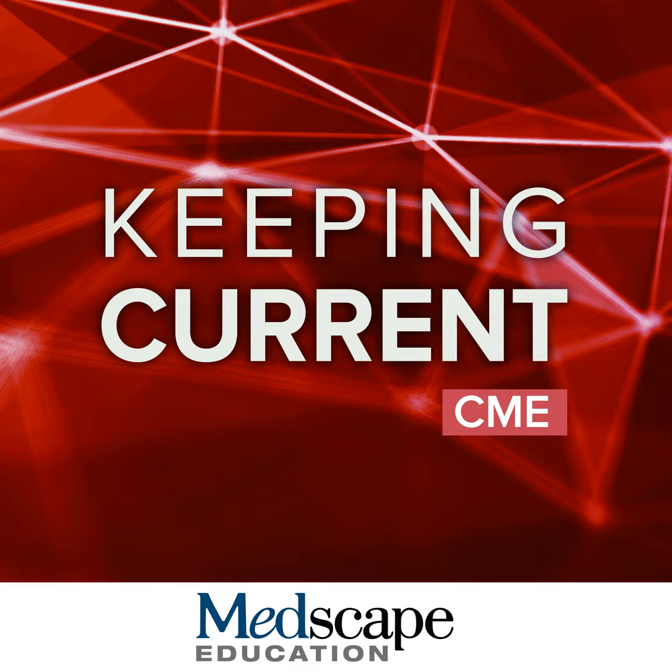Can we predict suboptimal hepatobiliary phase? Well, there's a study that showed that if you use direct bilirubin cutoff of 1.3 milligram per deciliter, you actually can be very specific and you can predict it. And so if you are protocoling and you have just put your direct bili automatically into protocol sheet, if you see that there is a direct bili that's less than 1.3, or there's no recent direct bili, we can proceed with gadoxetate. And if direct bili is 1.3 or greater, we can switch automatically to ECA.